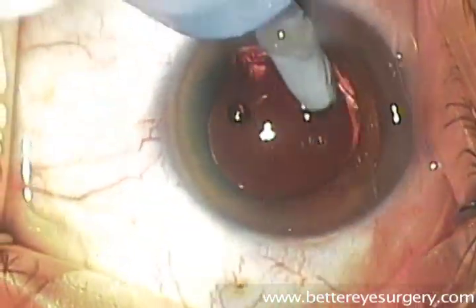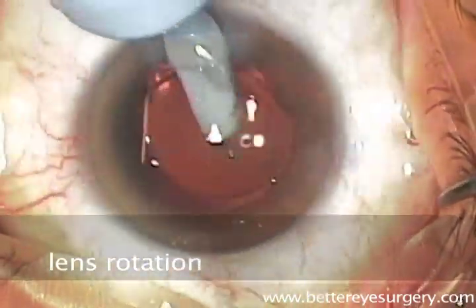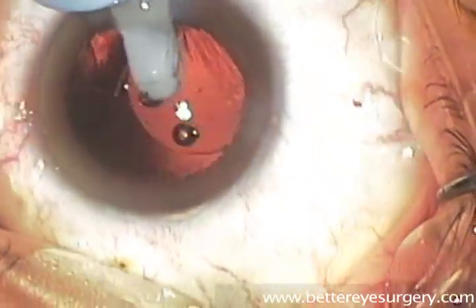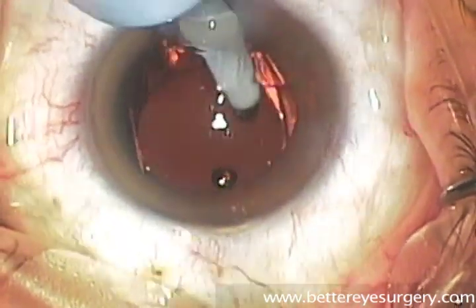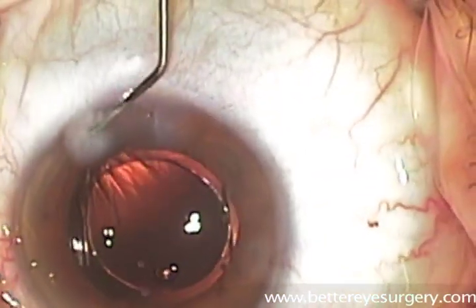Here we rotate the lens around, and this step is important because it allows the lens to find its final position in the ideal location in the equator of the lens capsule. It also allows us to fully remove any of the viscoelastic material and to loosen any final lens cortex that remains in the capsule.